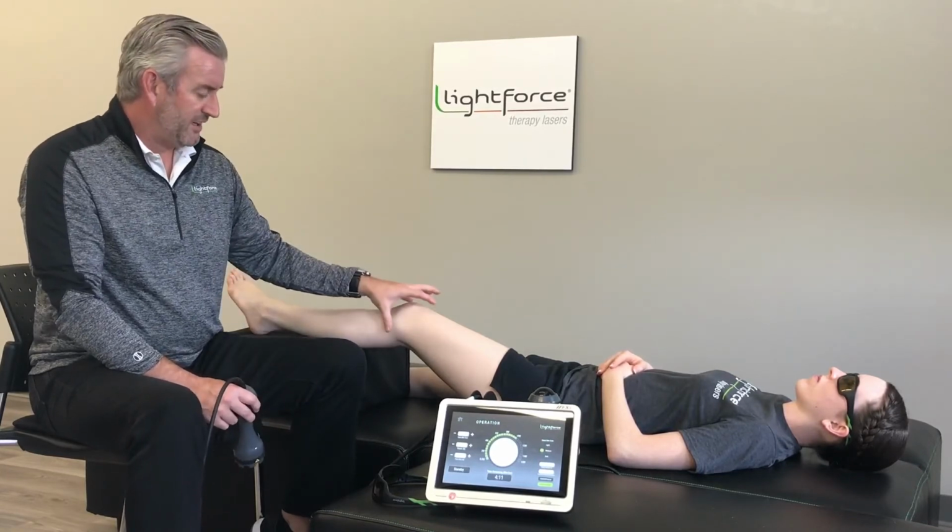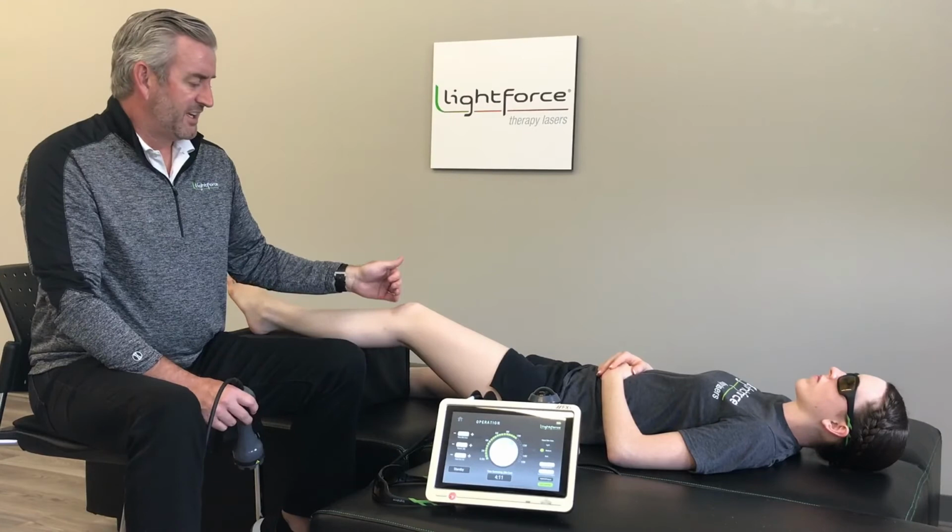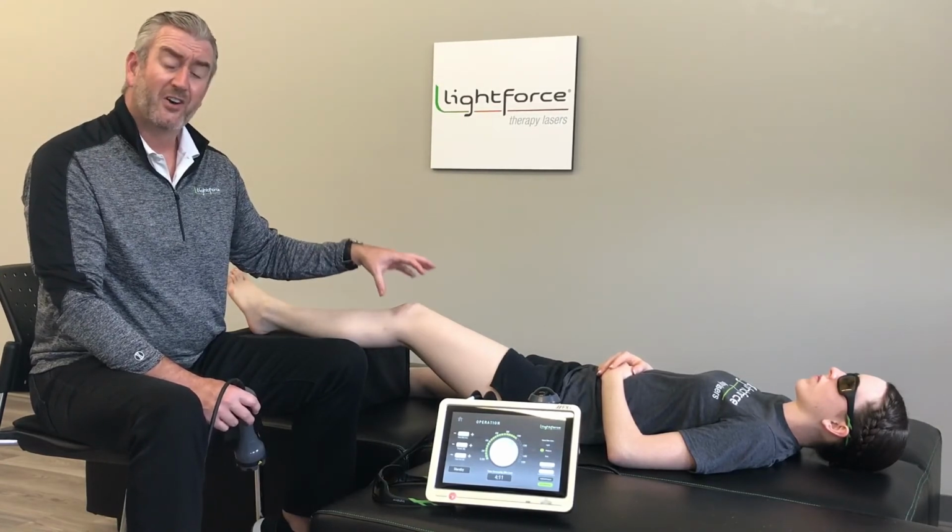The last treatment tip I'd give you is that when treating in an acute setting where you have swelling present in the knee, you're going to be, like we said, in that 6 to 8 joules per centimeter squared range to get pain relief if they were having acute pain. You're not going to want to go a lot hotter or higher with your power due to the possibility of increasing the chance of rebound pain.